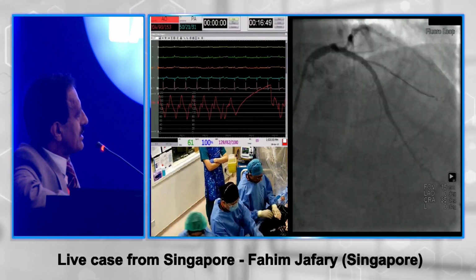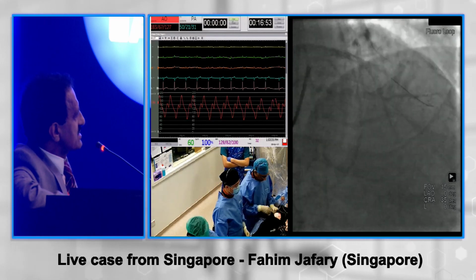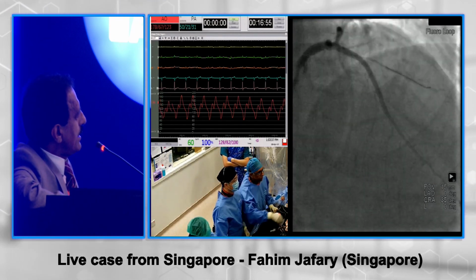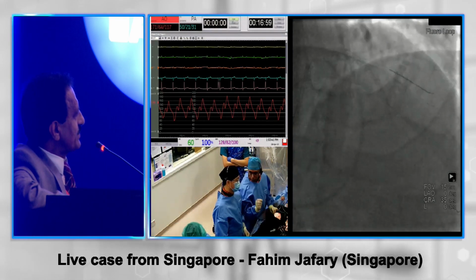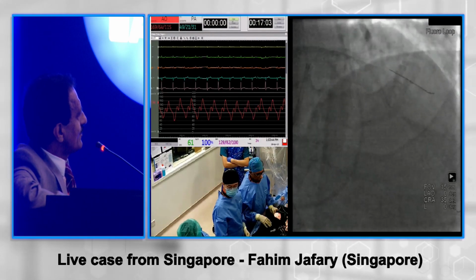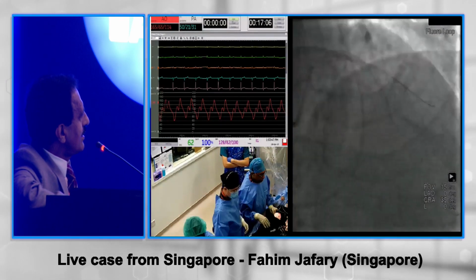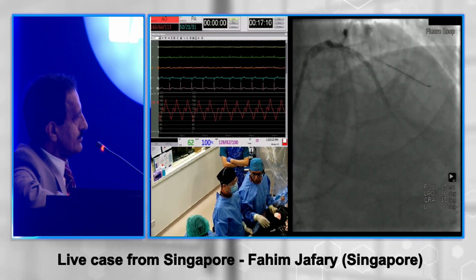Ashok, did you hear that earlier discussion about malapposition and underexpansion versus just looking at the area and being okay with it? If it is more than 5, it doesn't matter if it is underexpanded or malopposed. What are your comments about it? My view is, well, both are important, and let's not just have one or the other.